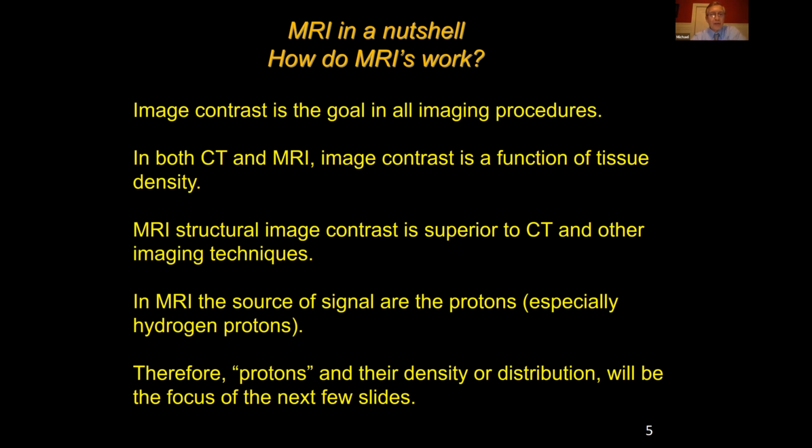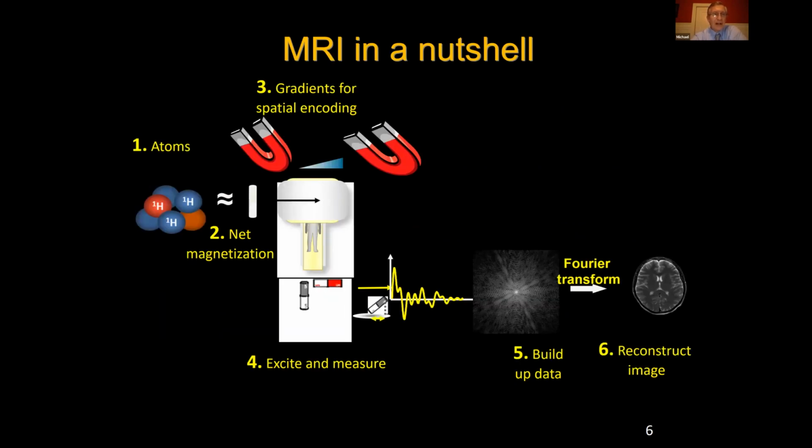And this is actually one of Chris Flask's slides that we use a lot. So we often think about the hydrogen protons, and when we put a person into a magnet and turn the magnet on, that electrical field spins the protons and aligns them. So that's what we mean by 1, 2, and 3. But I always think of MRI like an FM radio and a demodulator. And if you were able to listen to the body right now, you would hear all of our protons spinning in kind of a random order. It would sound like this.